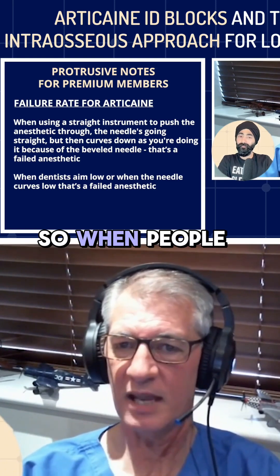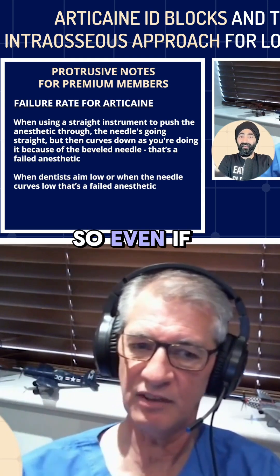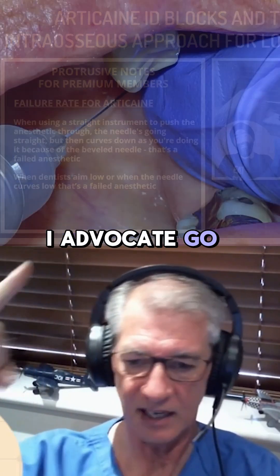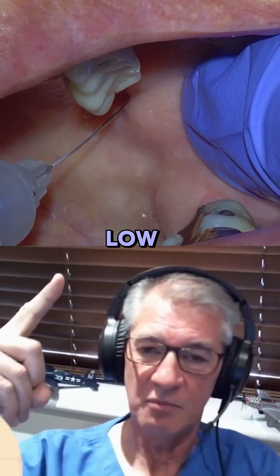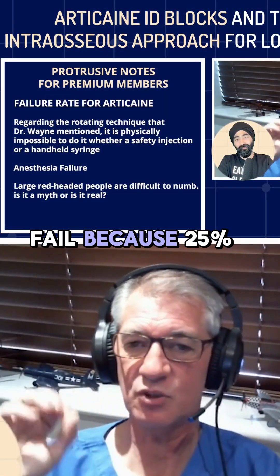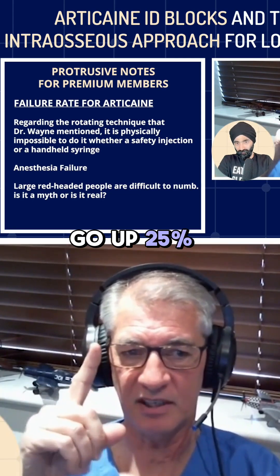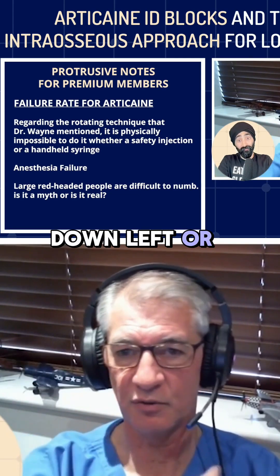So when people aim low, or when the needle curves low — even if you're aiming really high, which is what I advocate — go really high, go too high rather than too low. But if your needle then bends, you're still going to fail, because 25% of the time it can deviate either up, down, left, or right.